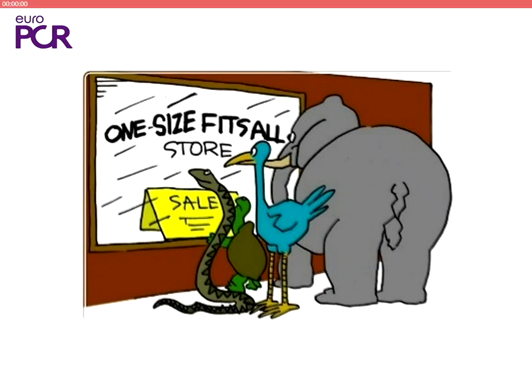I mean, here we have different problems all put together in one patient: a coronary aneurysm and an underlying disease that we don't know much about. What do you think eventually, because what are the options here? The options he described very nicely. You put a graft master in. The graft master wouldn't eventually change anything to exclude the aneurysm. Most likely, we know that you don't need a graft master in order to get thrombosis of the aneurysm by just conventional stenting, which might be advantageous due to the size of the circumflex artery. You can do traditional stenting with culotte in order to reduce flow and eventually cause thrombosis.